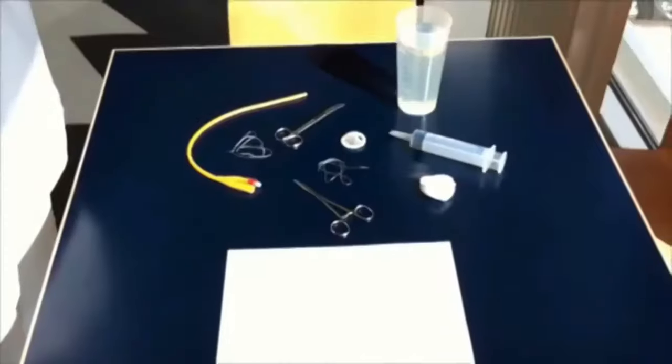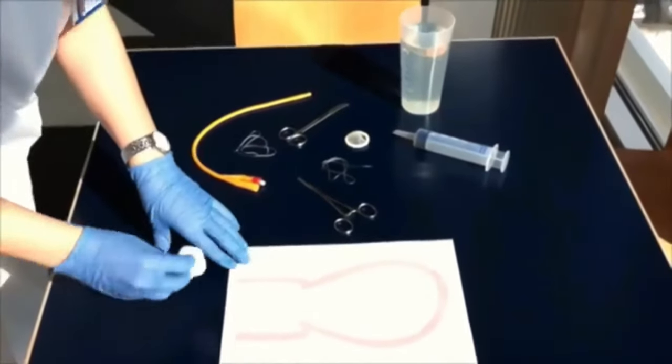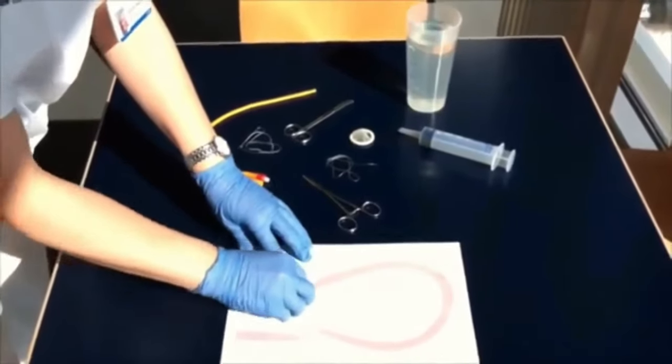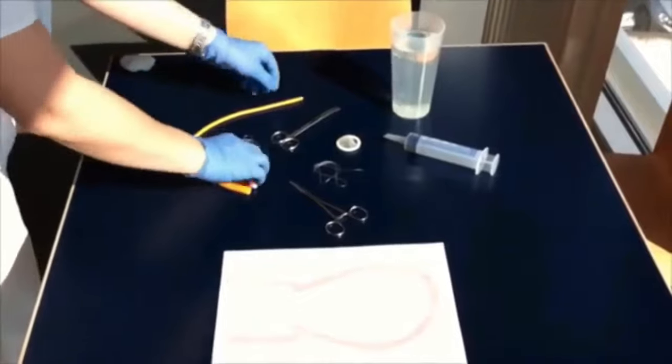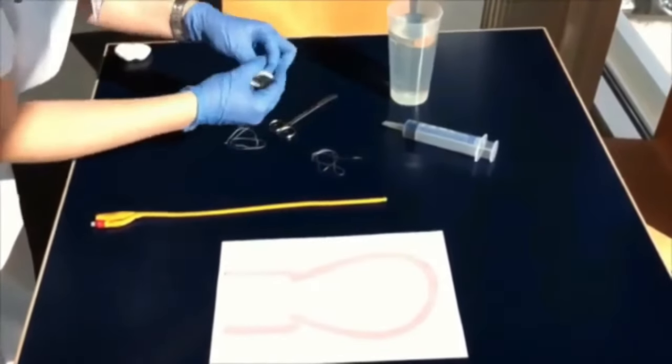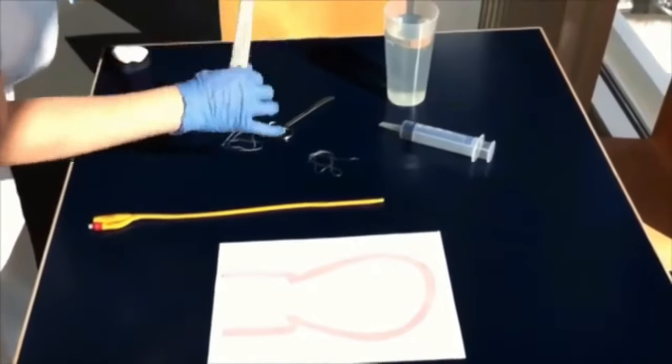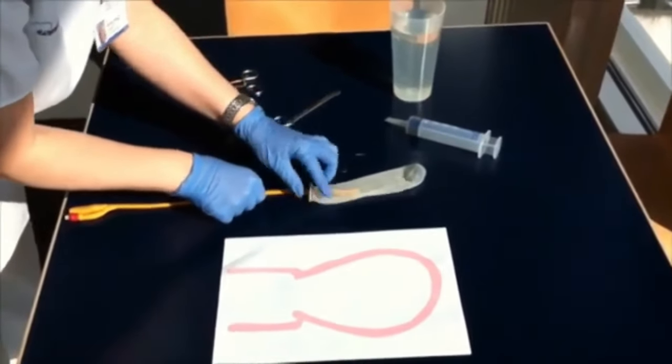Now, a uterus has been made on this piece of paper to show how easy it is to inflate a balloon. First, you have to clean the vagina so that aseptic precautions are taken before you insert a balloon tamponade into the uterus to prevent bleeding from the vagina and uterus.